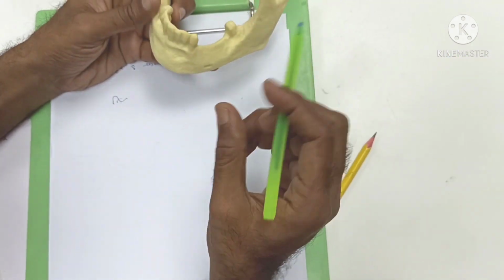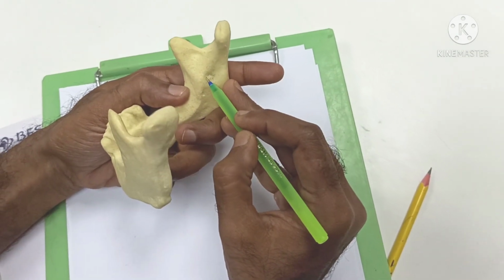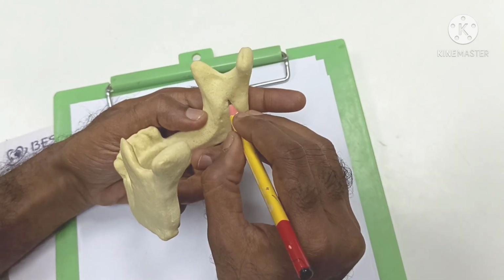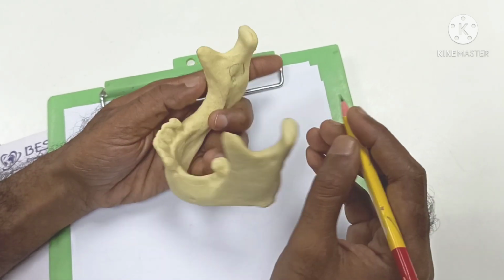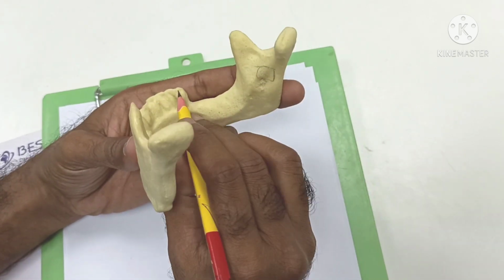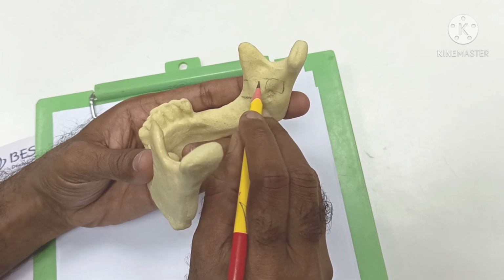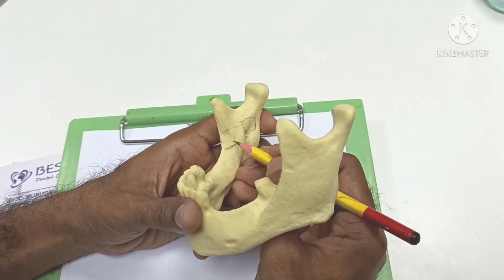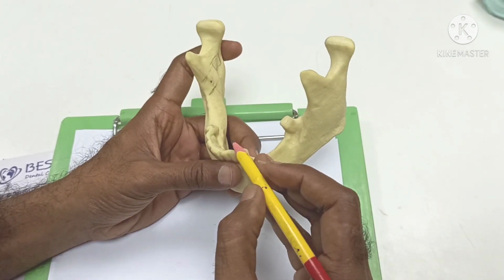So if you are injecting for the right side, this is the right side, and this is the foramen. Our target area must be here. That means this is the occlusion plane, so about 6 to 8 mm above the occlusion plane will be okay. If we locate the pterygomandibular raphe region, we will start the injection.